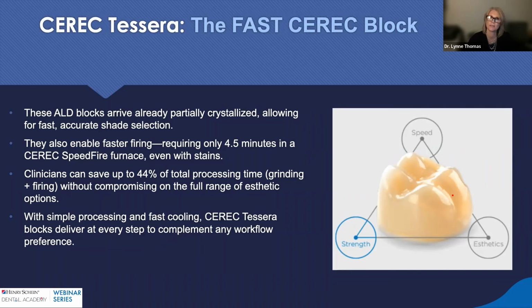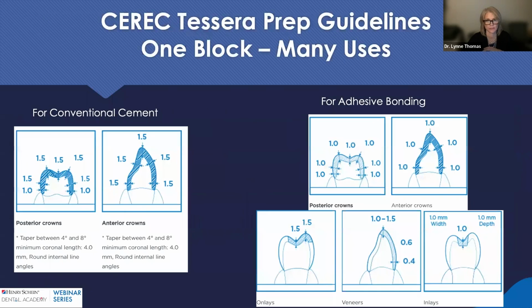So once I'm done milling it and I clean it up and glaze it, I'm going to put that through the speed fire for that quick 5 minutes, and then I'll go in and I'll try it in on my patient. The block is really, really beautiful when it's finished.